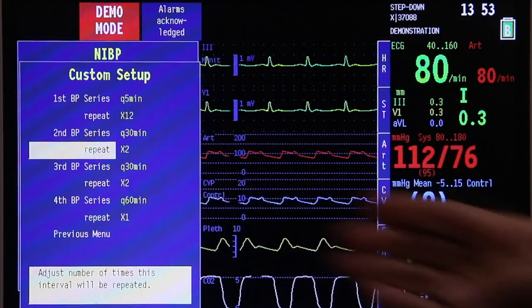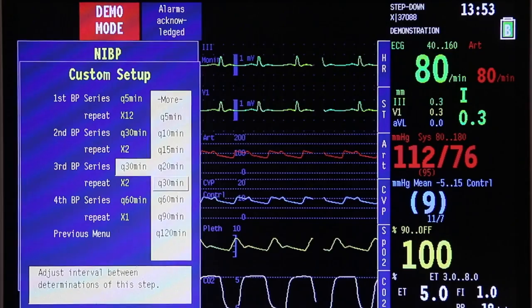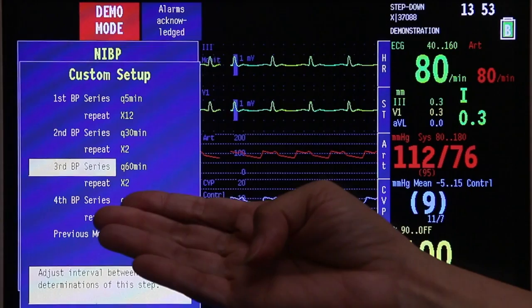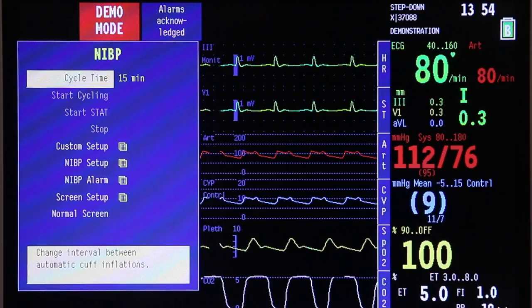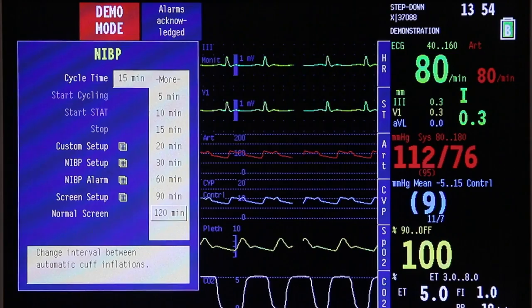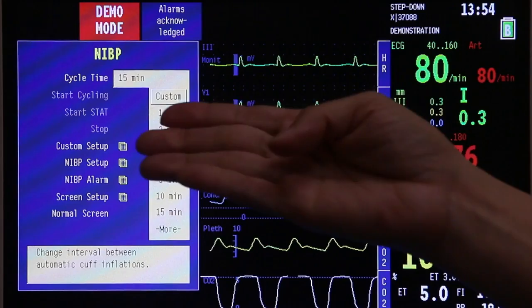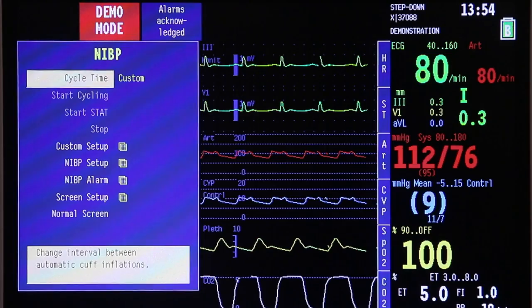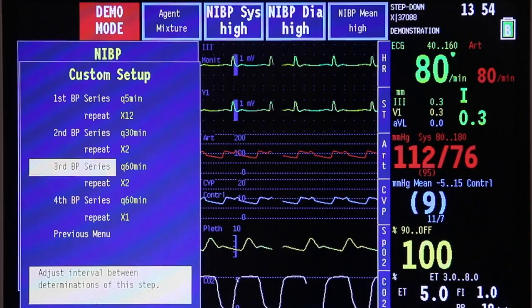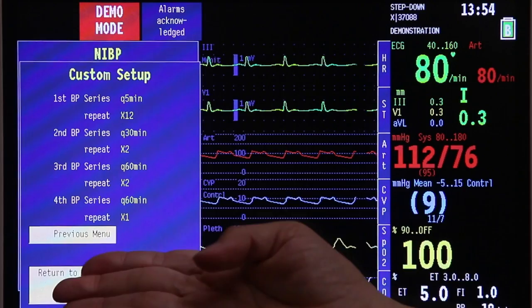After the 30-minute monitoring, you may want to keep monitoring every 60 minutes for another 2 hours. Once you are done adjusting, go back to the previous menu, press the trim knob, and go to your cycle time. Scroll until you see custom and select it. If you choose custom for the cycle time, the monitor will follow the cycling time set in the custom setup for your NIBP. Click the trim knob and go back to previous menu.